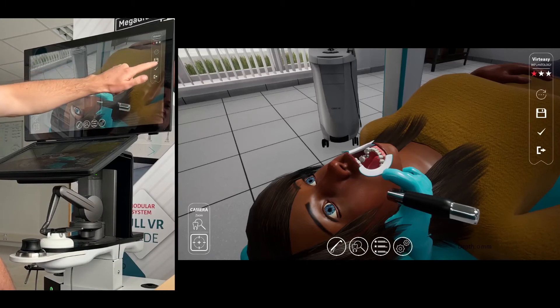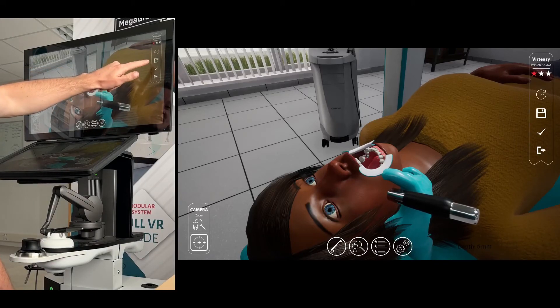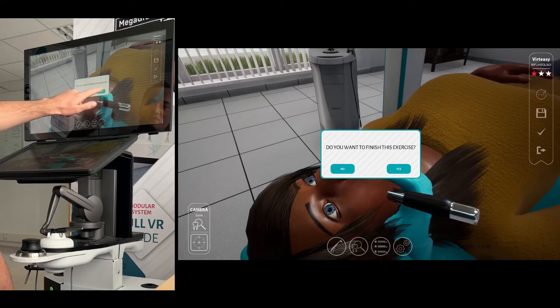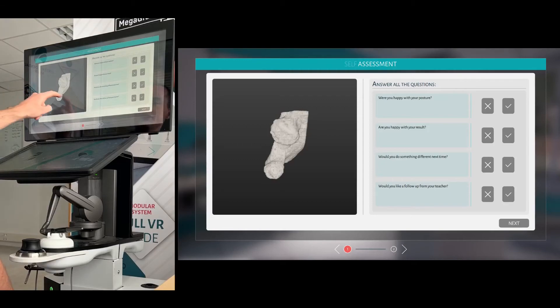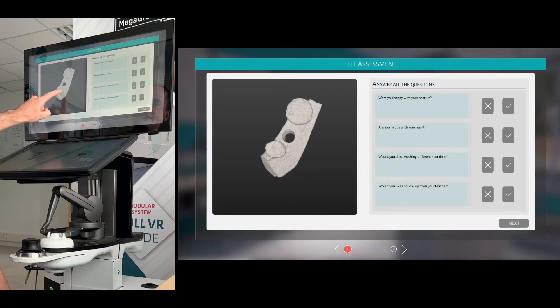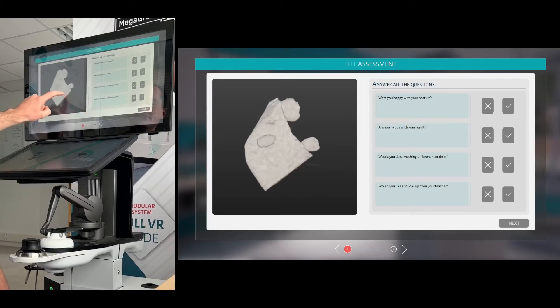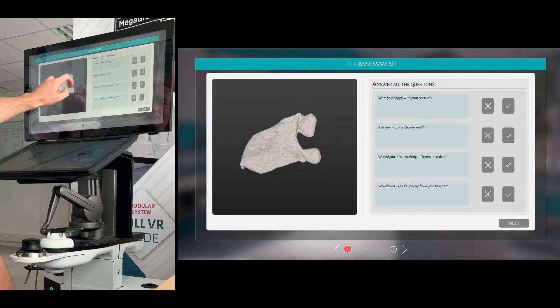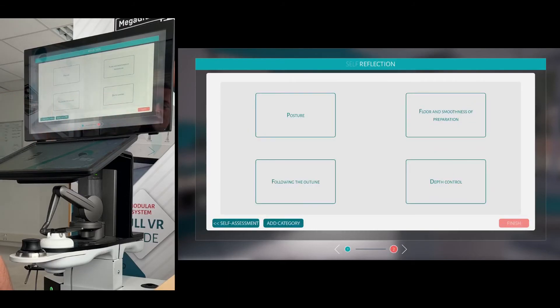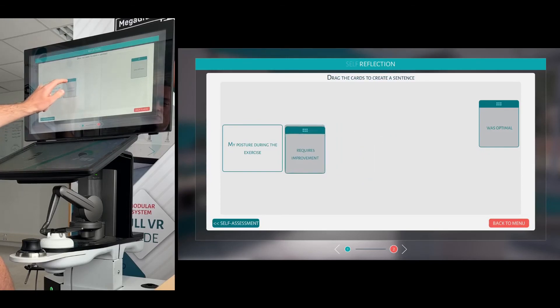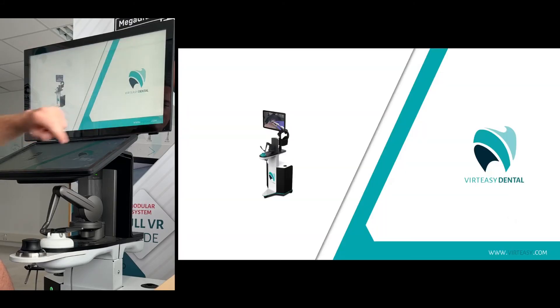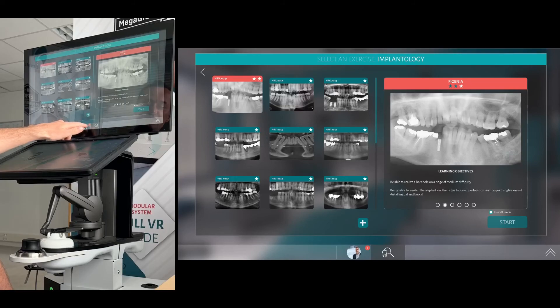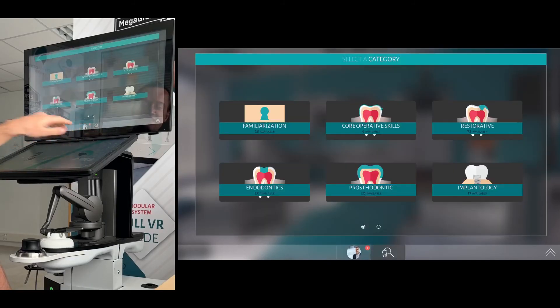And when you're finished in the top right you can reset, save, terminate or exit. So I'm going to successfully terminate the exercise. And then you'll see on here we get a 3D view where you can actually see the drilling I've done. You can see that hole has gone all the way through that jaw. You can answer the questions and then self-reflection on things like posture as well which perhaps requires improvement because I didn't sit in an ergonomic enough position. Click finish. And that saves all your data and if you have any notifications from your teacher you'll see that just as a little pop up just there.